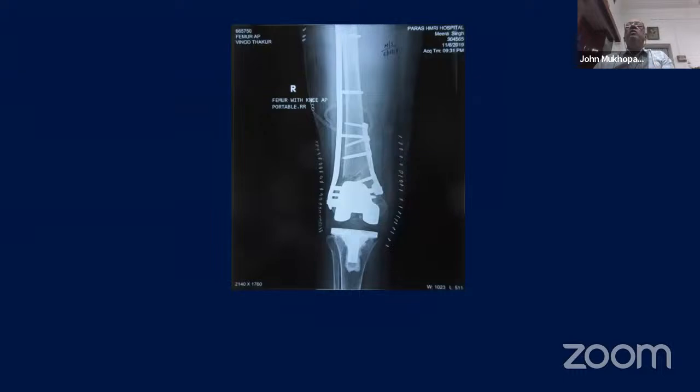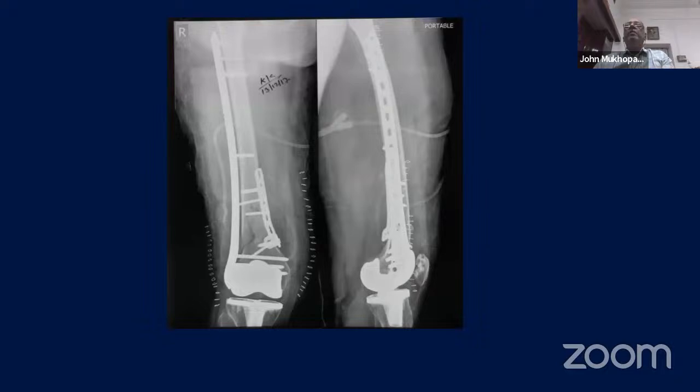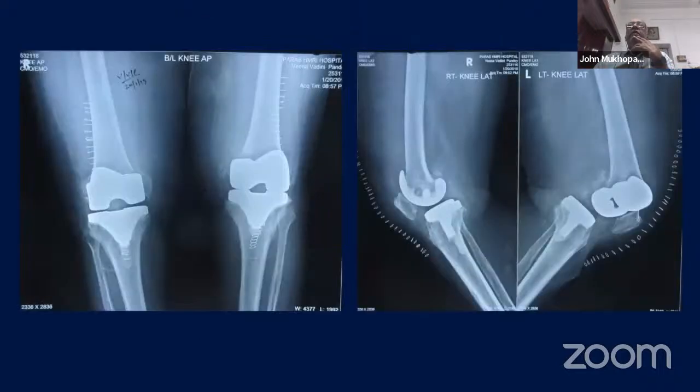And you can see how now this sits nicely on the fracture and it is fixed with a posteromedial buttressing of the fracture and a long lateral plate, which will give you a good stable fixation and allow you early mobilization. So here's another patient who had this fracture, again treated similarly. You can see a long lateral plate, a posteromedial buttressing of the beak of the fracture. Again, you can see the fracture medially goes more proximally than the lateral side, which is more distal. And again, you can see how this is going on to heal with time.